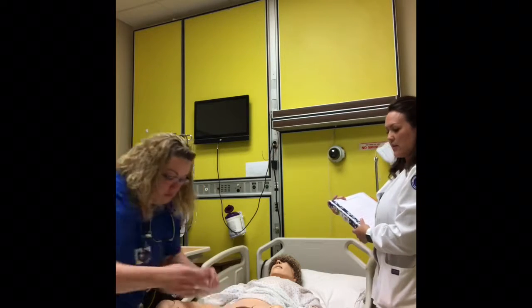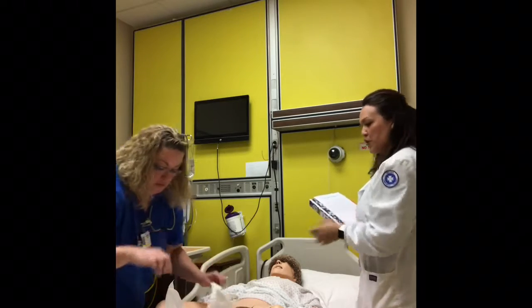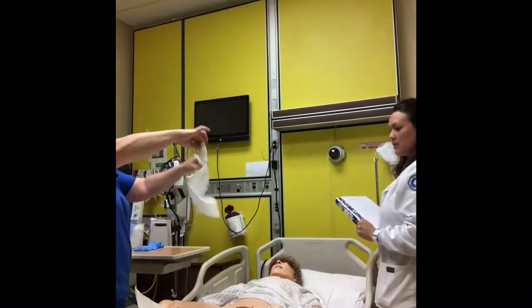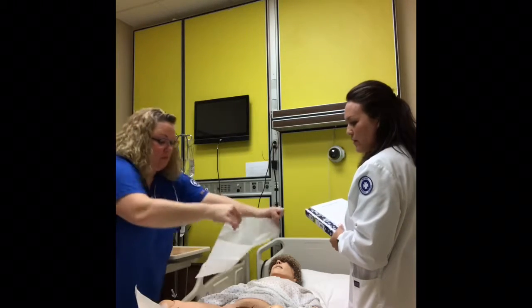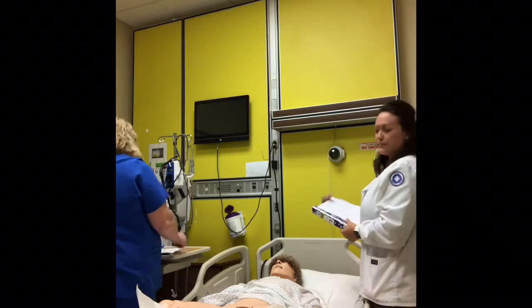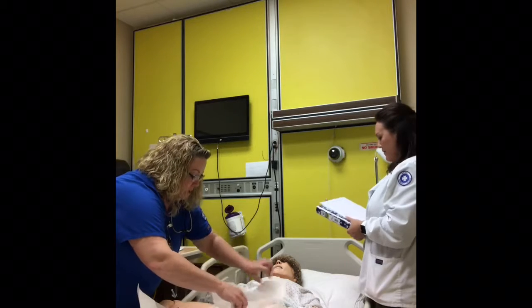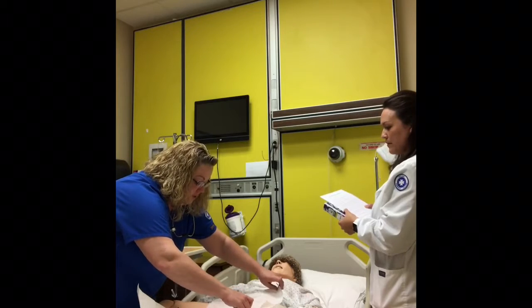Very good, sterile technique. Just grab the edges. There should be a pair of sterile gloves right on top. Go ahead and grab that and place that over the genital area. Oh, that's the absorbent one. That's okay. Where's the other one? Oh, the other one's right there. These are my sterile gloves, which I'm going to place here on the desktop. And then this is the cover. Either way you put it, whether long ways or sideways, just so long as you only touch the outer parts.